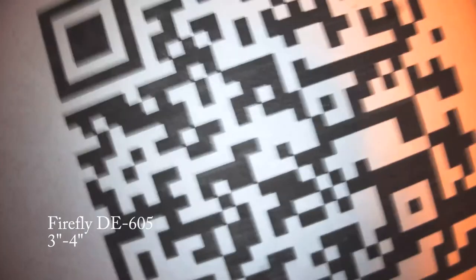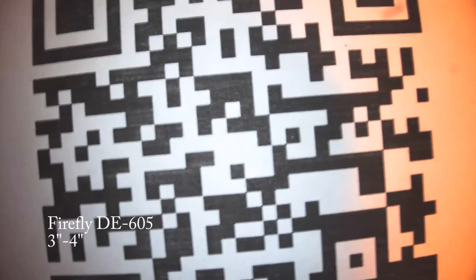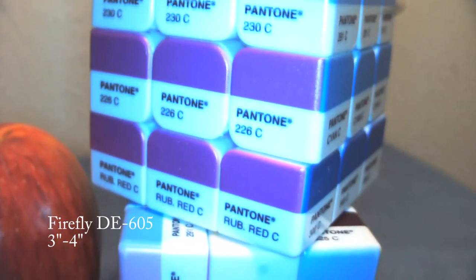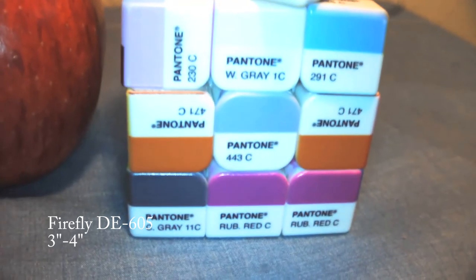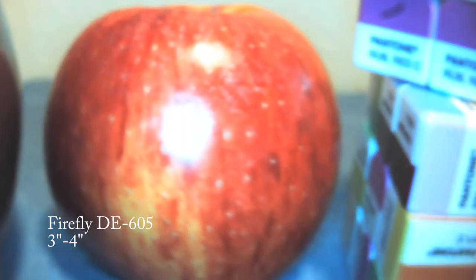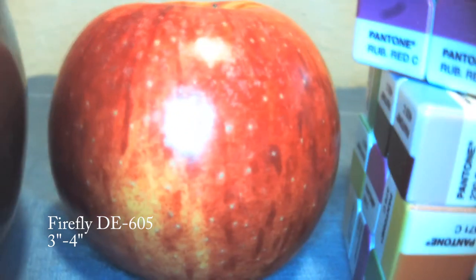In this demonstration, we will show the ability of the Firefly DE605 to capture images of test objects at a distance of 3 to 4 inches from the camera lens. This view is useful for viewing details like eyes, rashes or lesions, inter-oral imaging, dermatology, neurological, and general exam.